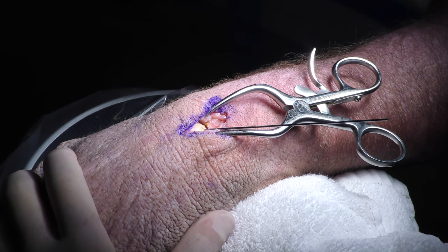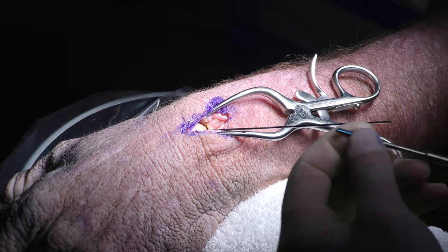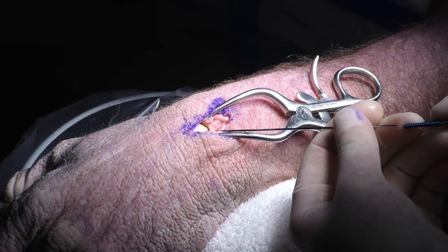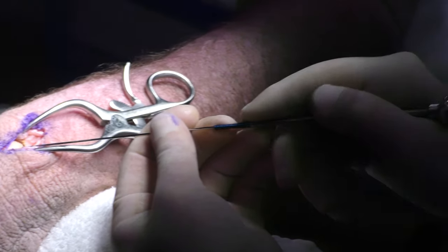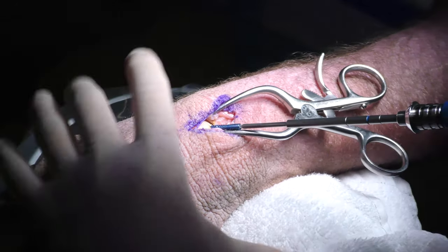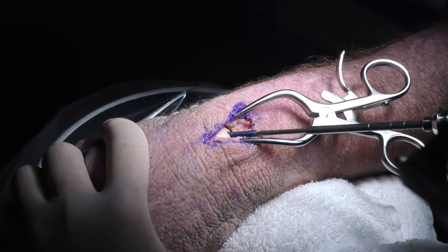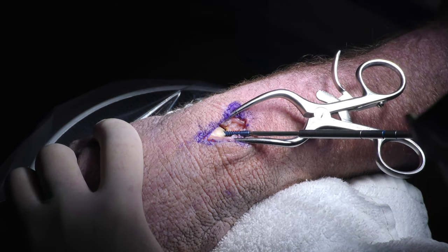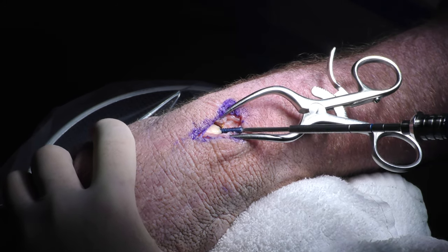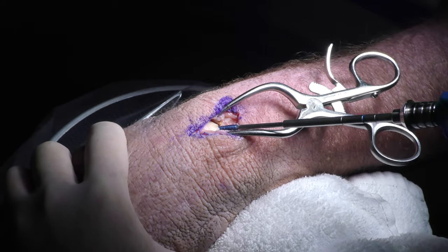So be careful with the screws when passing them, and when you're putting them on the wire, get a good hold of it. It slides down the wire pretty easily. Try to keep some soft tissue out of it. And then I always will start the screw, and I kind of turn it slowly. And then it will advance very easily. And of course, in a fractured specimen, when you get across the fracture site, it gets much tighter.